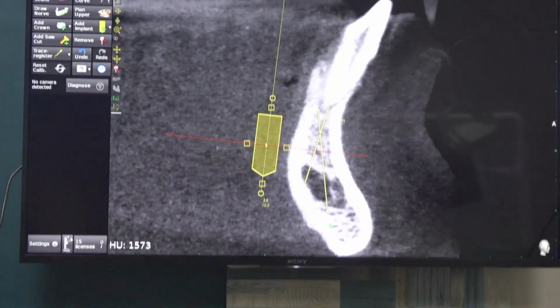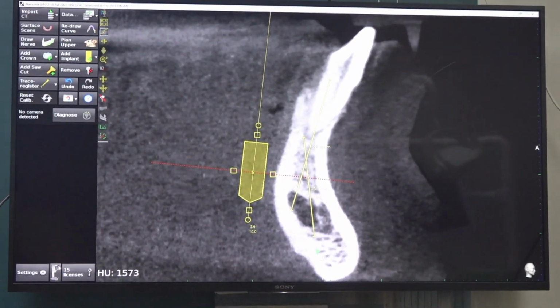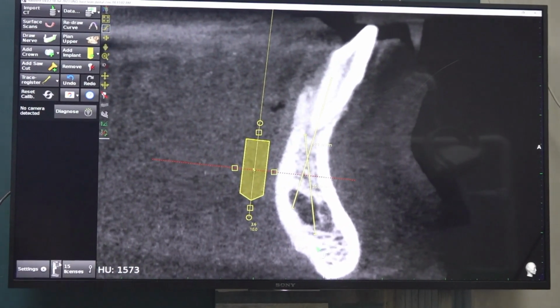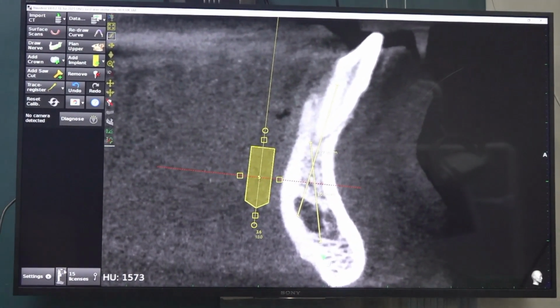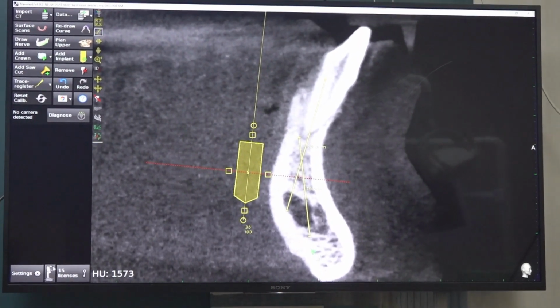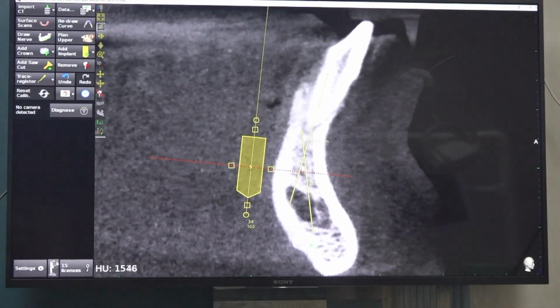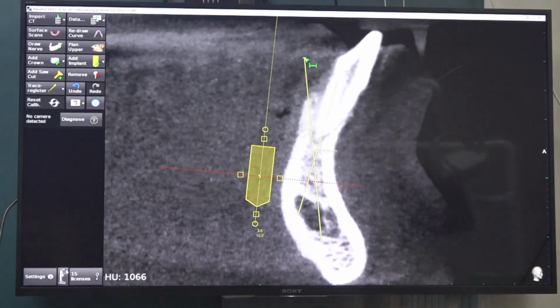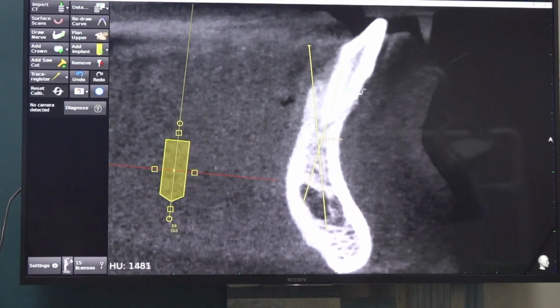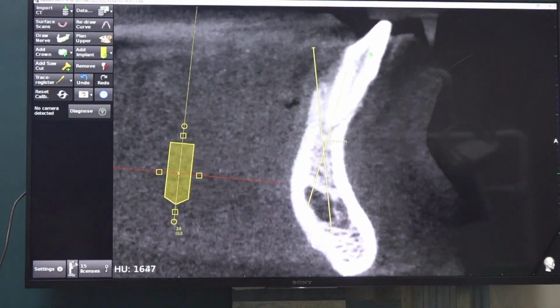So the risk of lingual perforation is more when you do only lower anterior cases. If you do full mouth with good alveoloplasty, there is no risk of lingual perforation because the drilling angulation is better now. But between these two drilling options, the abutment location is good when you go along the apex; the abutment will come in the correct position.